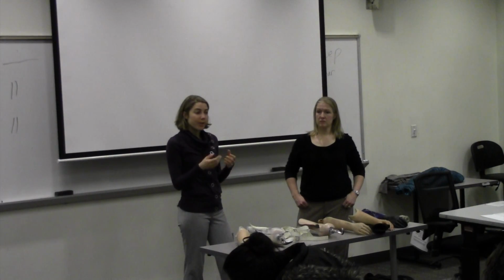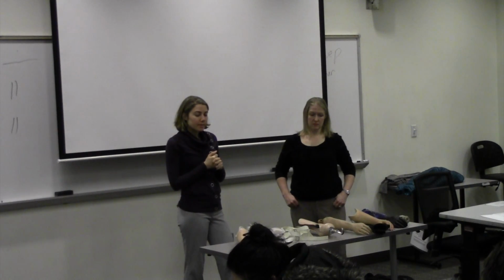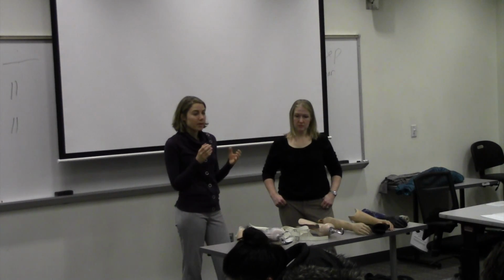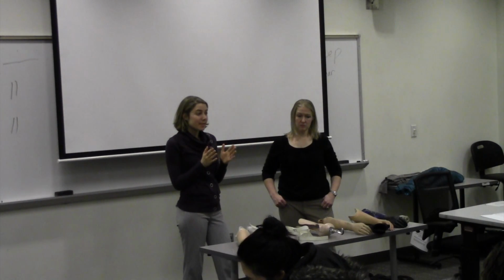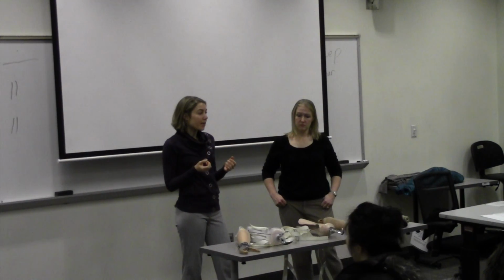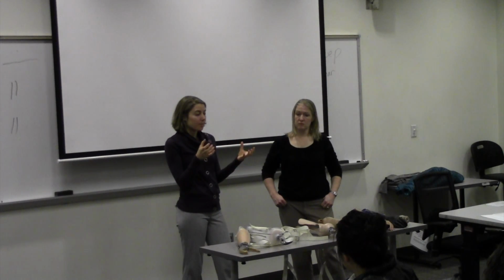So we just wrap it with fiberglass, as if someone were to break their arm. We just wrap it and mark bones and different landmarks in order to create this socket that the patient's going to put their limb in, that's going to apply pressure to places that the body can tolerate pressure, and relieve bony areas where it would hurt if the patient had pressure on that area. From there, we fill that model with plaster, and we end up with a little plaster model of the patient's limb.